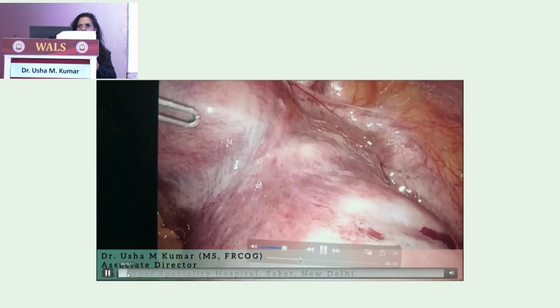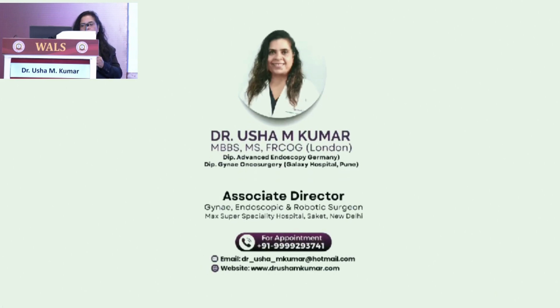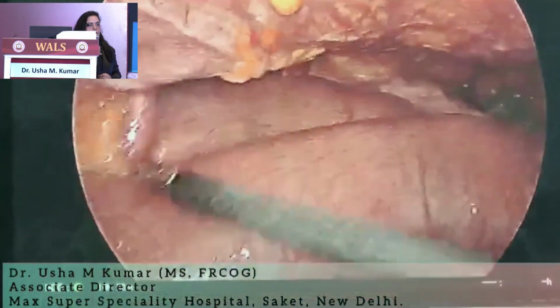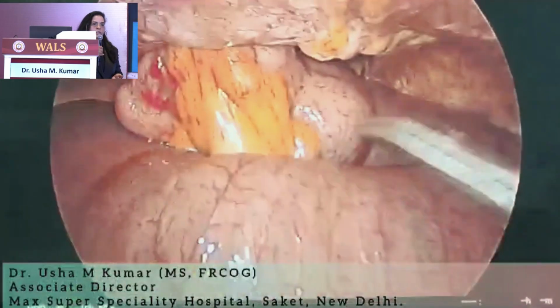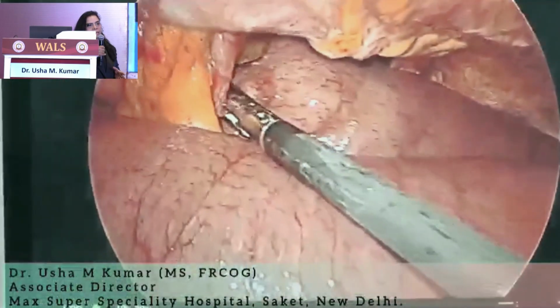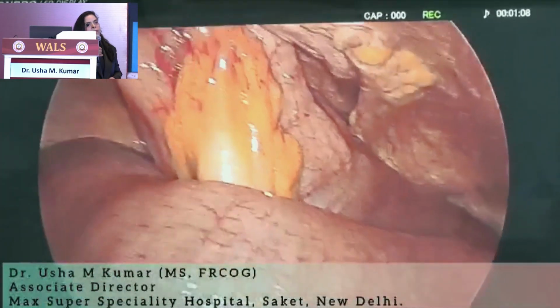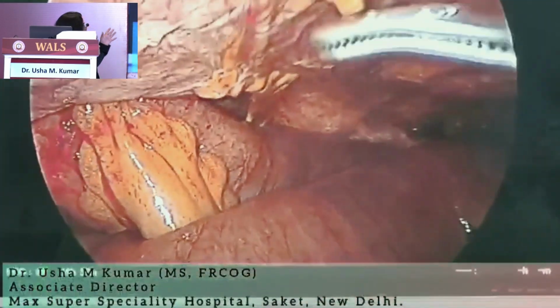So one should not be doing uncontained morcellation, because we know the risk of uncontained morcellation, besides spreading, upgrading the sarcoma, adenomyosis, but there is a risk of disseminated leiomyomatosis peritonealis, which we may think is imagination and very rarely happens, but I have seen patients who got operated 3 years after the surgery. She came back to me, and when I put the scope, there were myomas loaded everywhere.